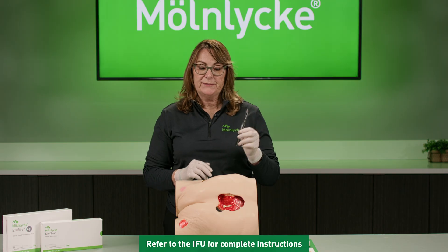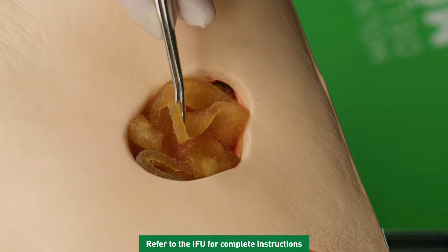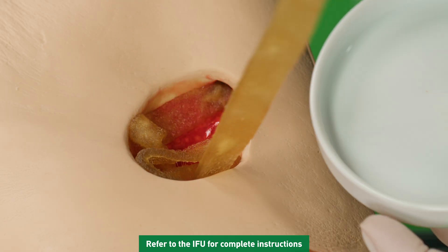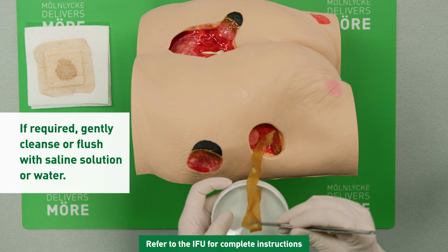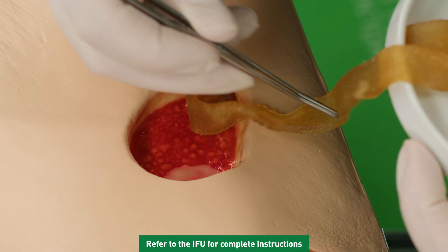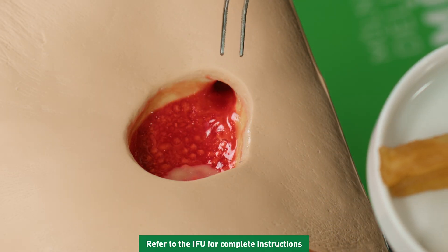In this instance, I'm going to use forceps. In reality, you might use a gauze. I'm going to begin by removing the dressing, noticing that I'm taking it from the undermined area and then gently removing it from the tunnel as well.